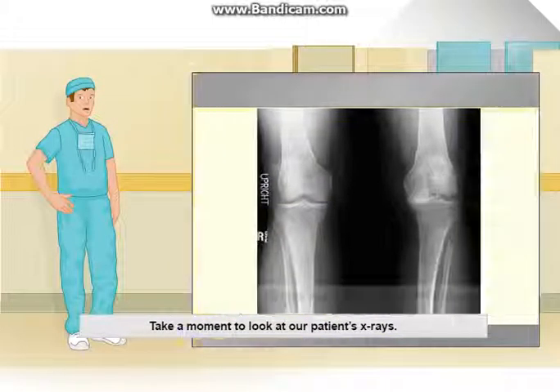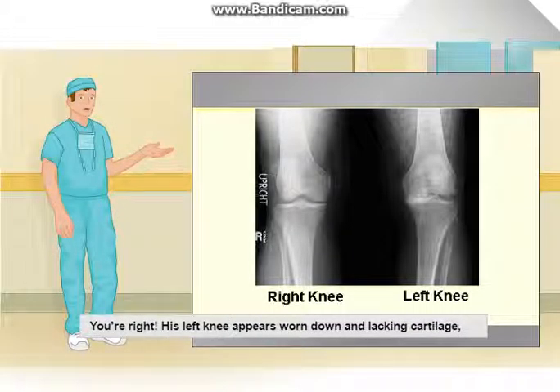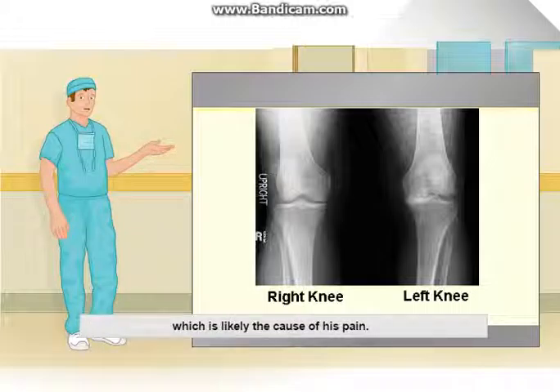Take a moment to look at our patient's x-rays. Which knee do you think needs surgery? You're right. His left knee appears worn down and lacking cartilage, which is likely the cause of his pain.